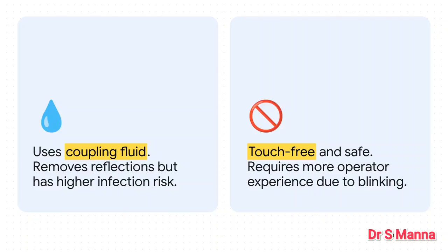This brilliantly illustrates the classic clinical trade-off. Contact instruments give you a slightly easier time with reflections, but non-contact instruments are generally preferred for patient safety, even if they demand a steadier hand.